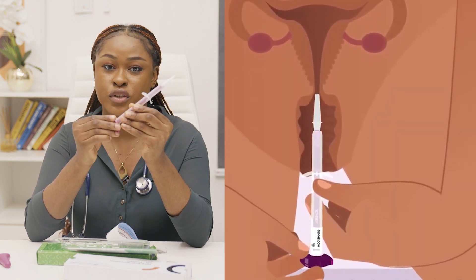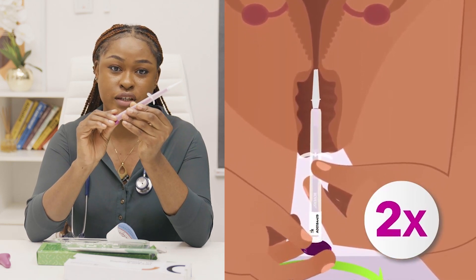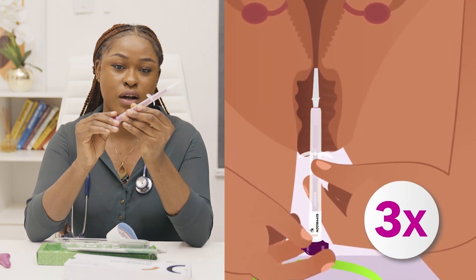Step 8: Turn the pink plunger 5 rotations in the same direction. After each rotation, you will hear a click. This helps you count the rotations.